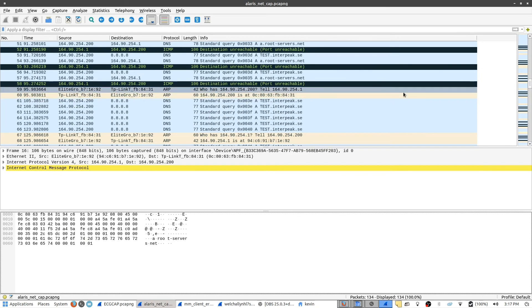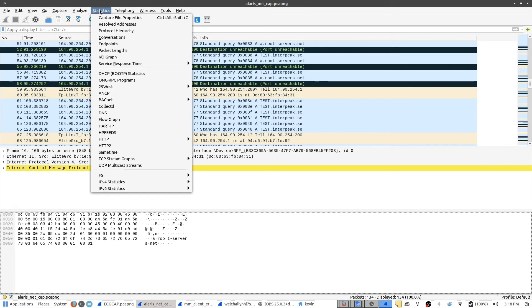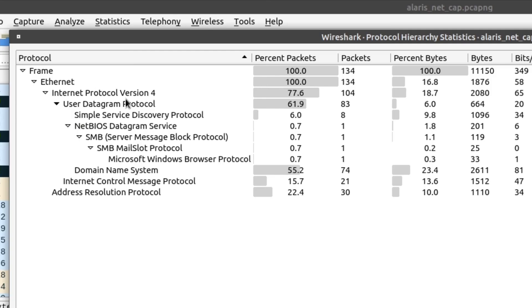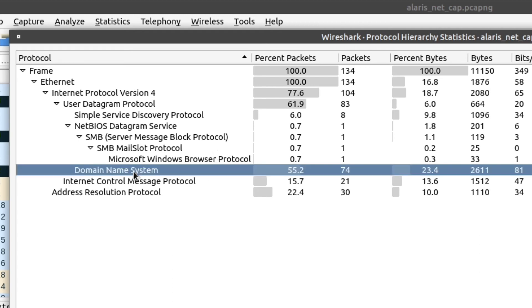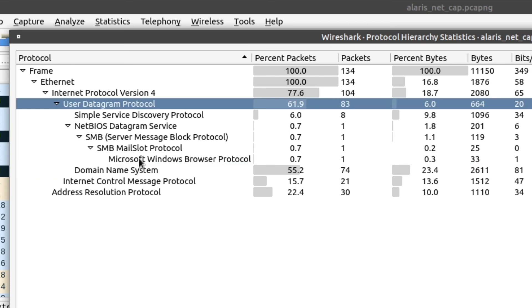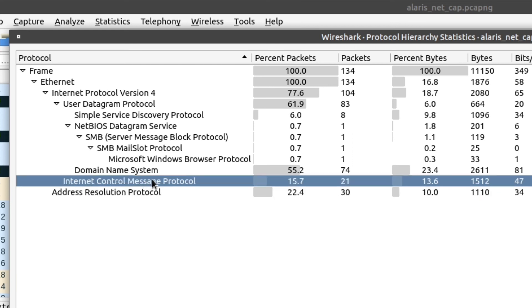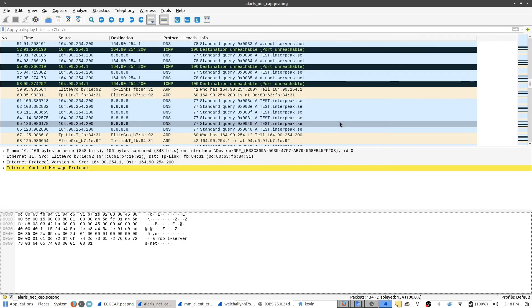Finally, we can also get an idea of the scale of what it's doing if we go to statistics and protocol hierarchy. It gives you a hierarchy of the actual protocols coming through and what's being done — and in this case, a percentage of what packets are most found in this capture. You can see that almost all of them are UDP packets, specifically DNS requests, ARP requests. There are a couple of ICMPs, but there's never any kind of actual data being sent through the line.